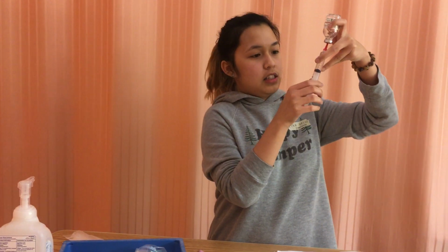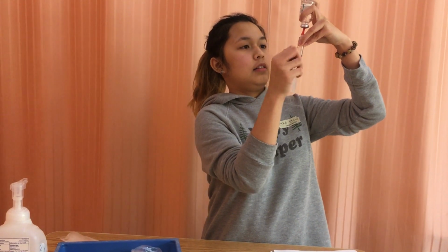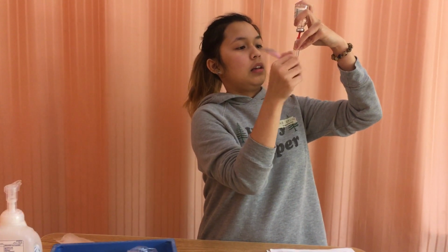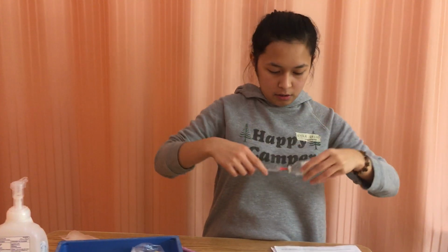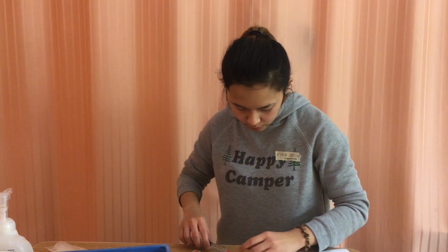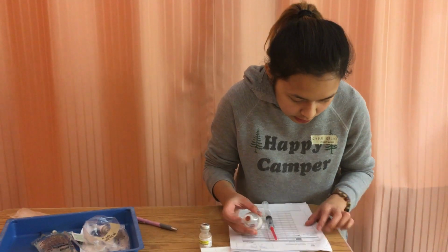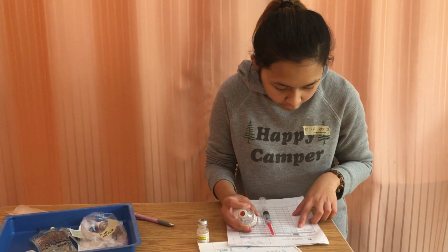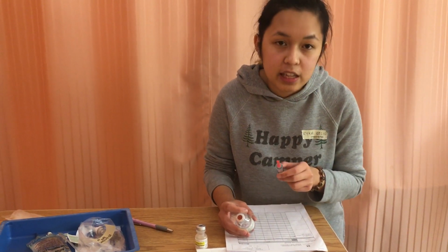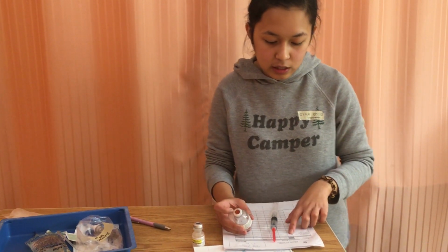Now that I've got 7 milliliters, I'm going to tap to get rid of the air bubbles. At this time, I'm going to do my second med check. Take this syringe. So this is still for the patient Regina Phalange, and this is the penicillin G sodium, 3.5 million units, and I've drawn up those 7 milliliters. And this is to be given IV every 4 hours. The time is 1800.